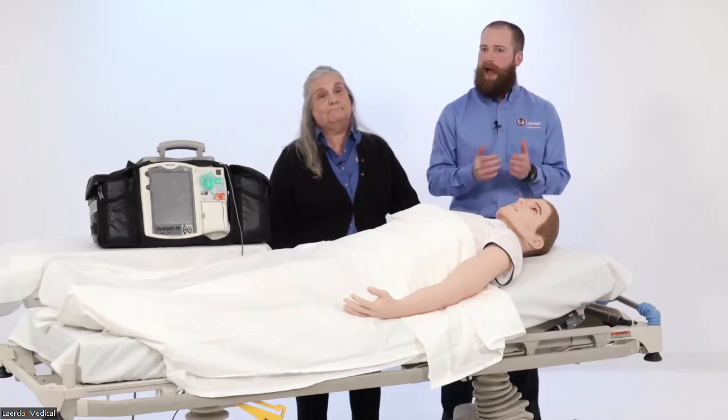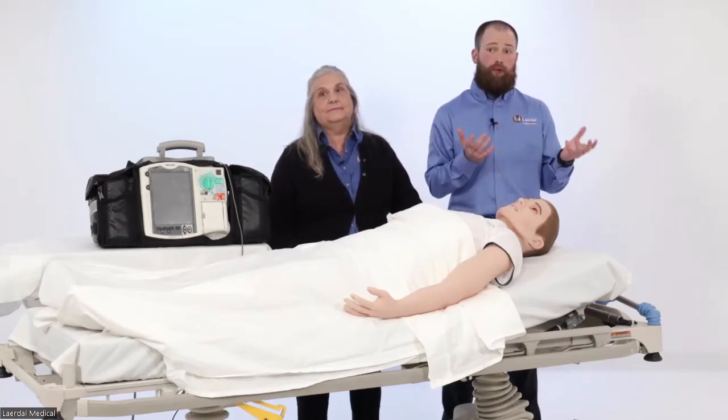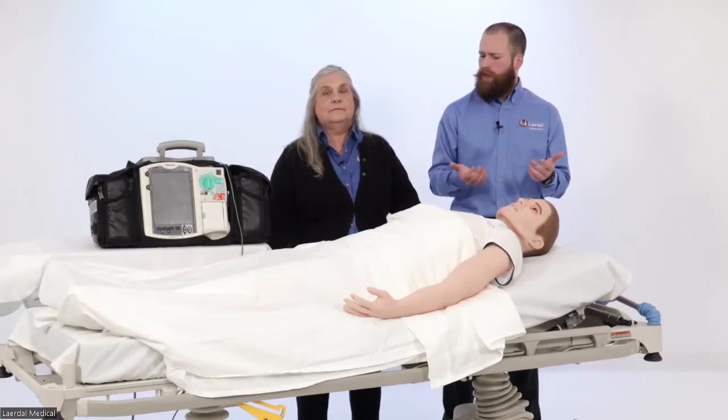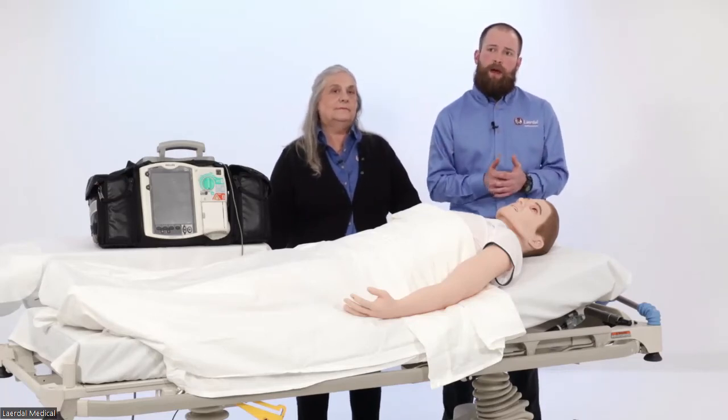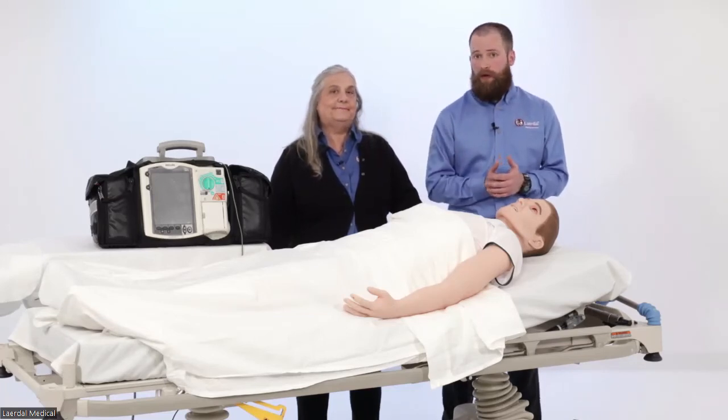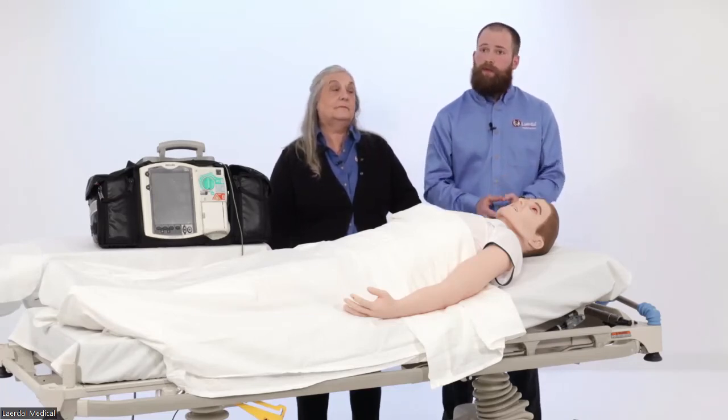We have a question on battery life. Is the battery life improved on 3G Plus, or is it the same as 3G? I don't know that anything has changed with the battery specifically, but one factor to note is that without that internal router being powered, that may lead to some improvements as well.